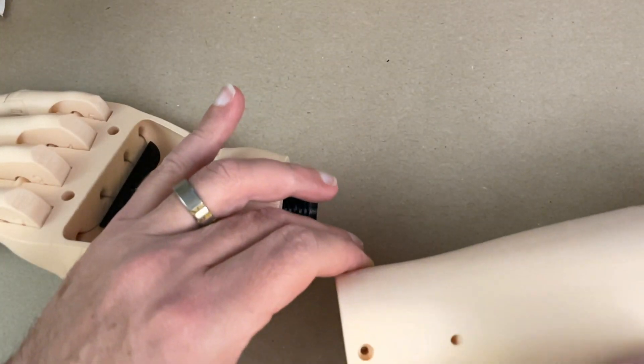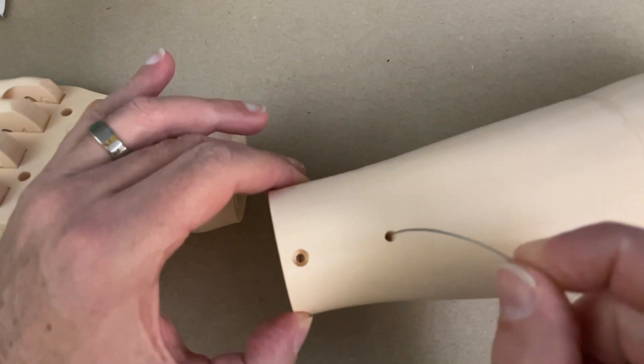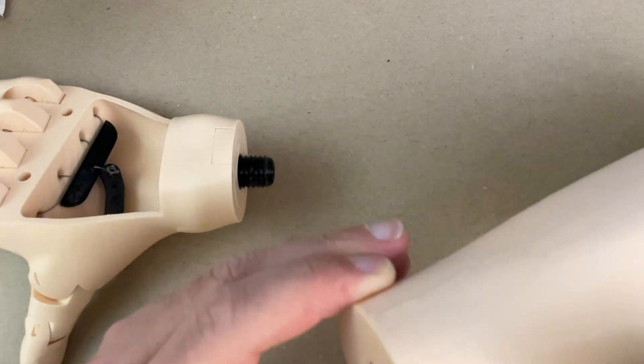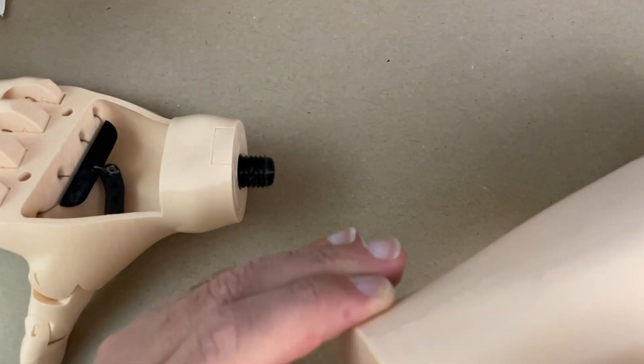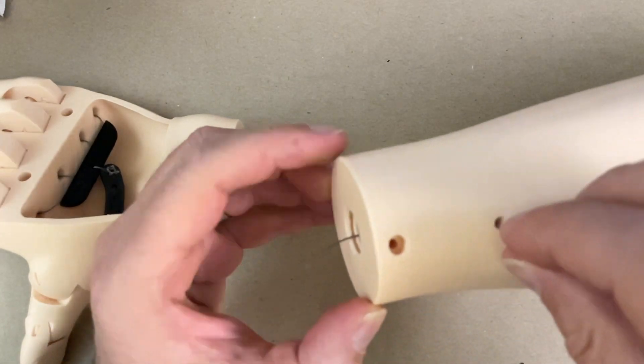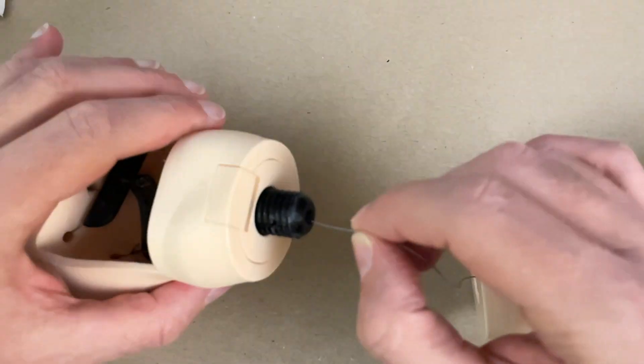Now I'm going to thread the fishing line through the arm. I think it's easier to do before you attach the two together. I can reach through this hole and down through the screw hole pretty easily, and then feed that through the hole in the center of the wrist bolt.